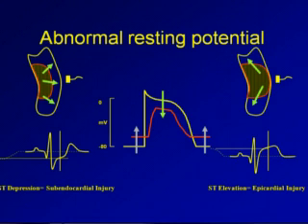Now, if my injury then gets all the way to the epicardium, if my lead's looking here, he's going to see an electrical current running away from him in diastole. So we start here, he's going to see negative deflection in diastole. You finish depolarization, we get back to the true 0 point, and the ST segment appears to have been shifted upward. When you see an ST segment shift, and it's shifted downward, that's said to represent subendocardial injury, because we know it hadn't gotten all the way through to the epicardium yet.